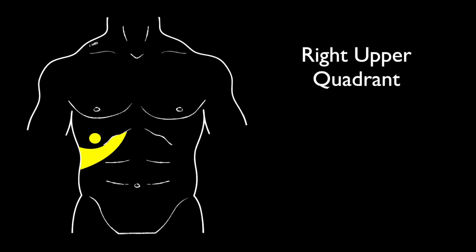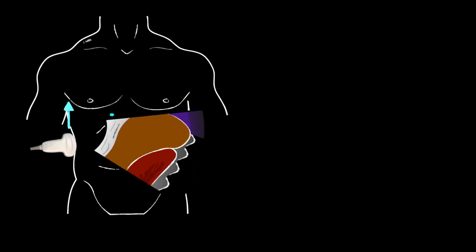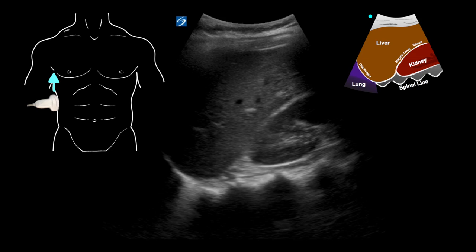When starting in the right upper quadrant, you can go from anywhere along the costal margin on the anterior abdomen over to the mid to posterior axillary line. I personally like the posterior or mid axillary line, and we're going to evaluate the pleural space and diaphragm down through the inferior tip of the liver or kidney. We'll focus on finding the spine line and watching it insert into the diaphragm. We can see that there's no free fluid here — even though this area appears anechoic, because the spine does not continue above it, there's no free fluid present.